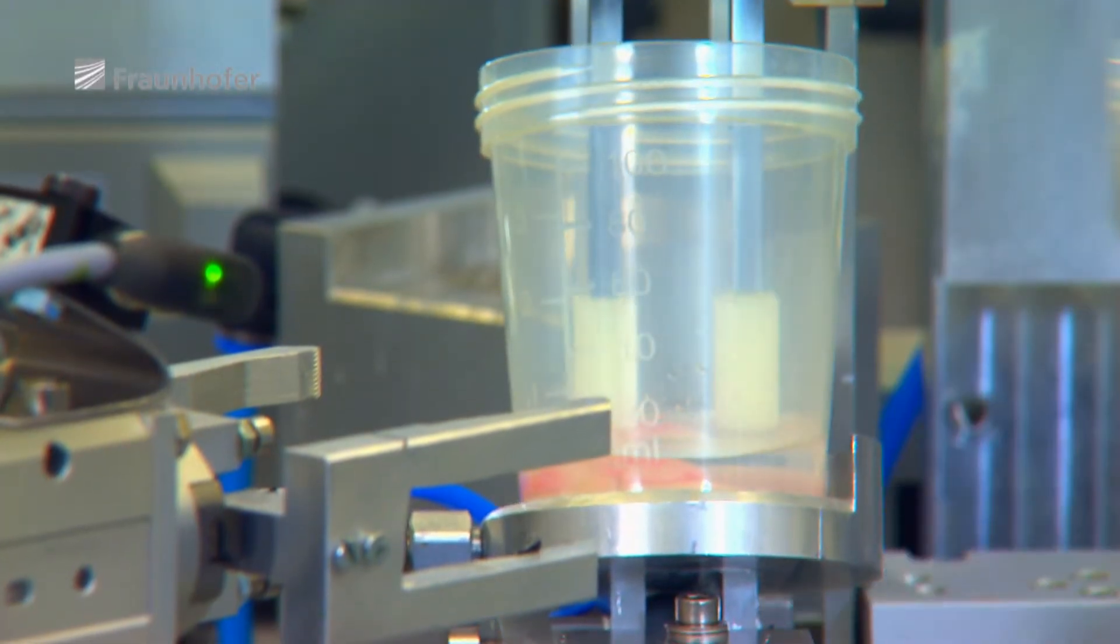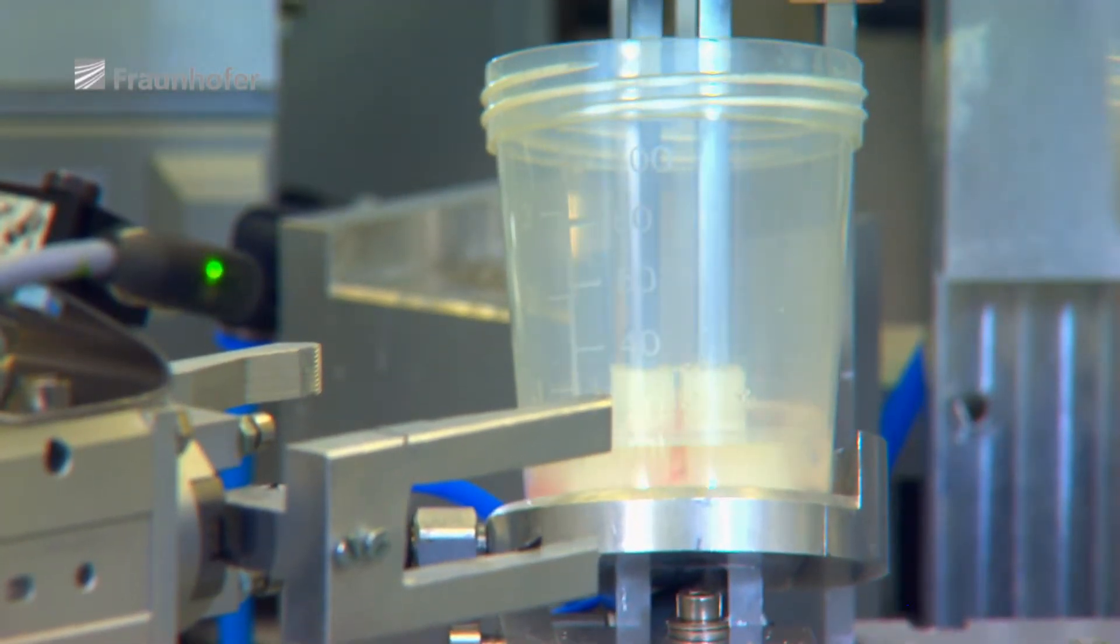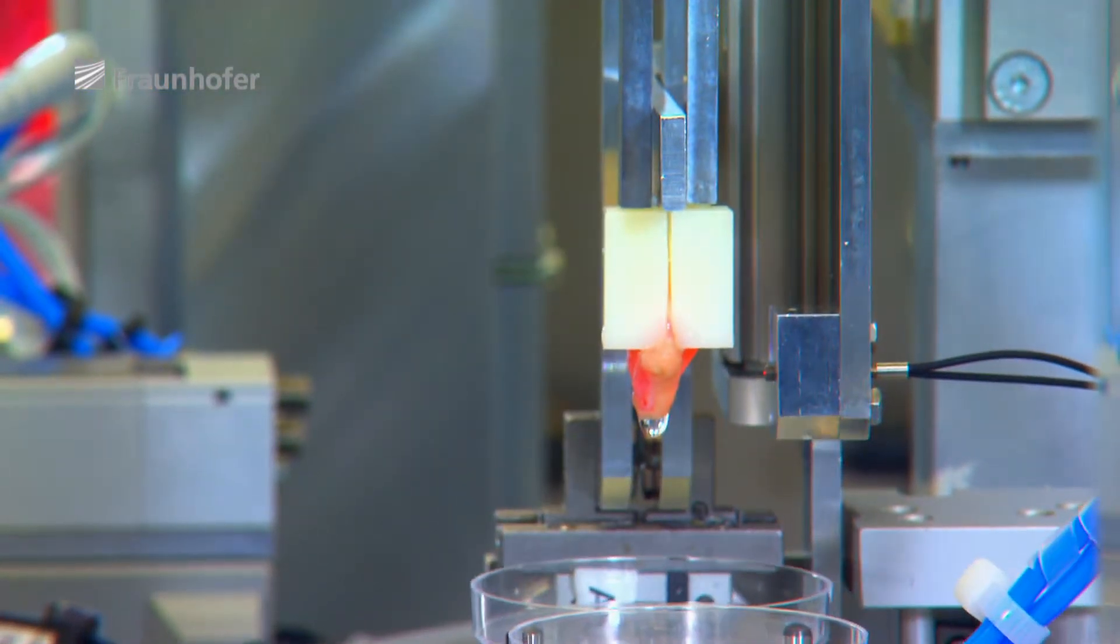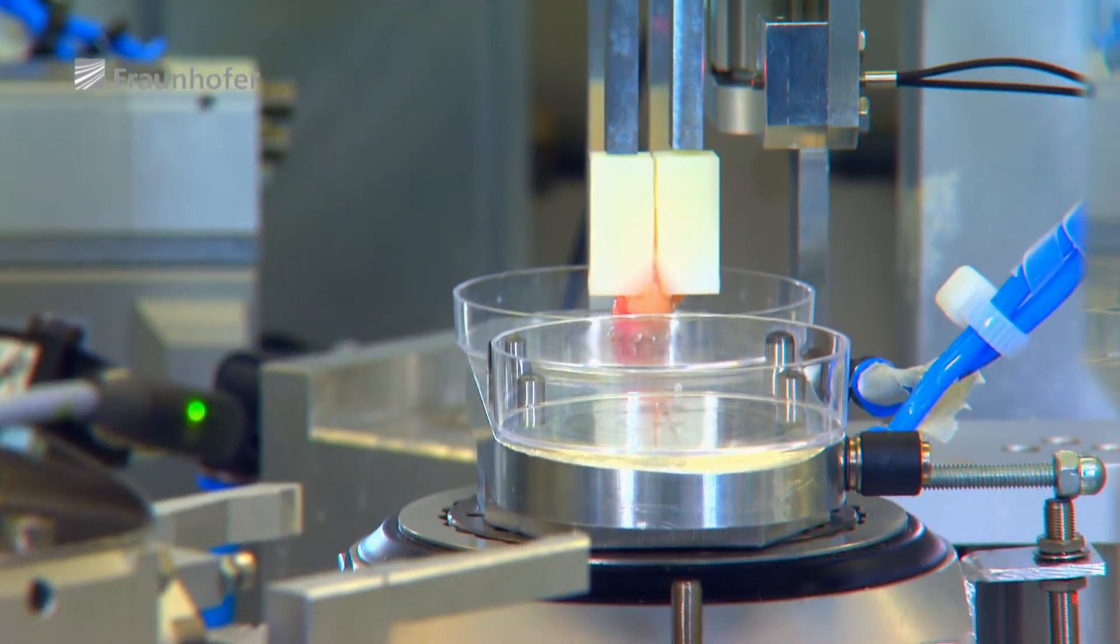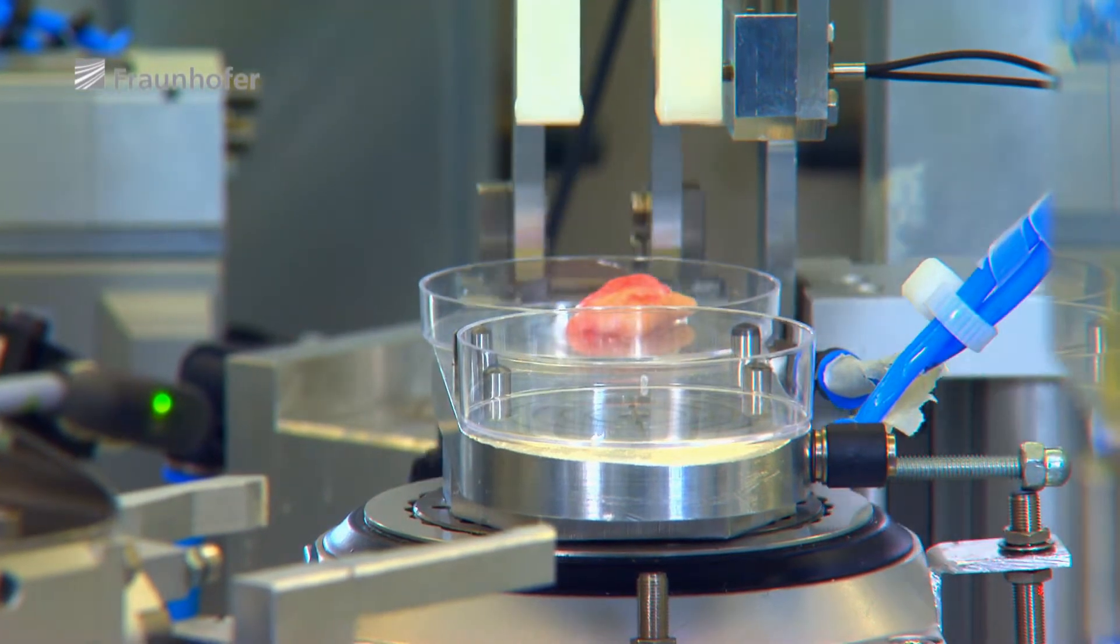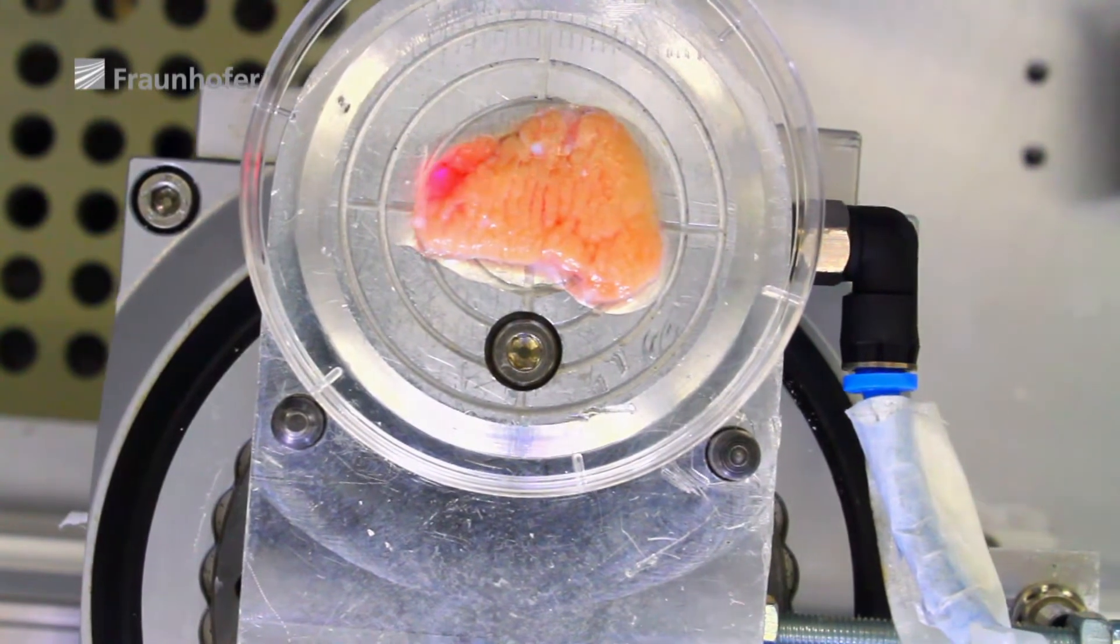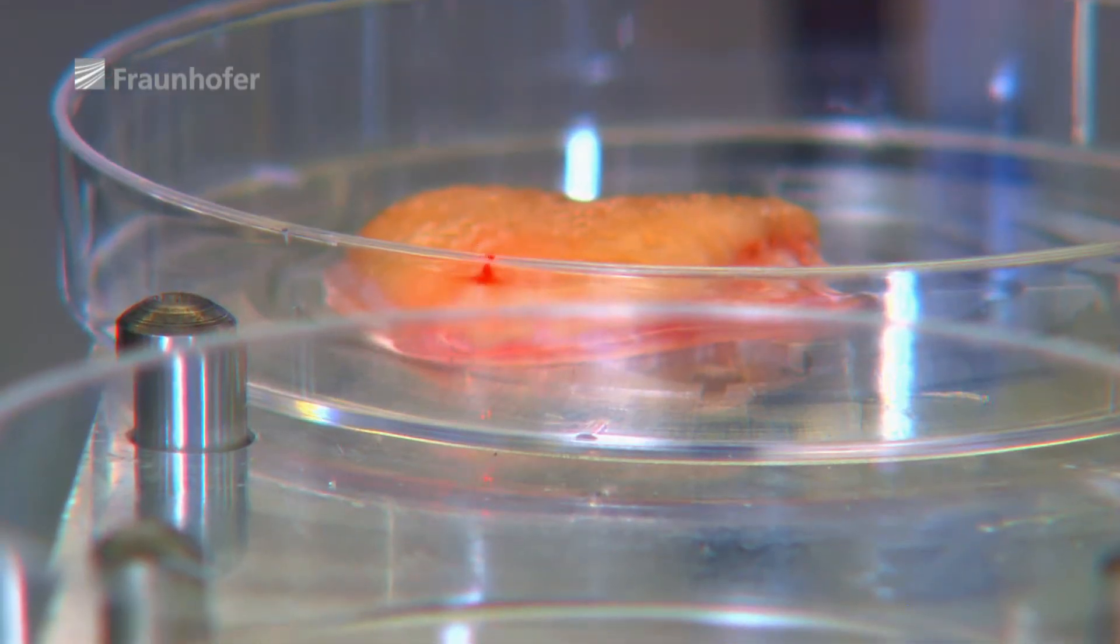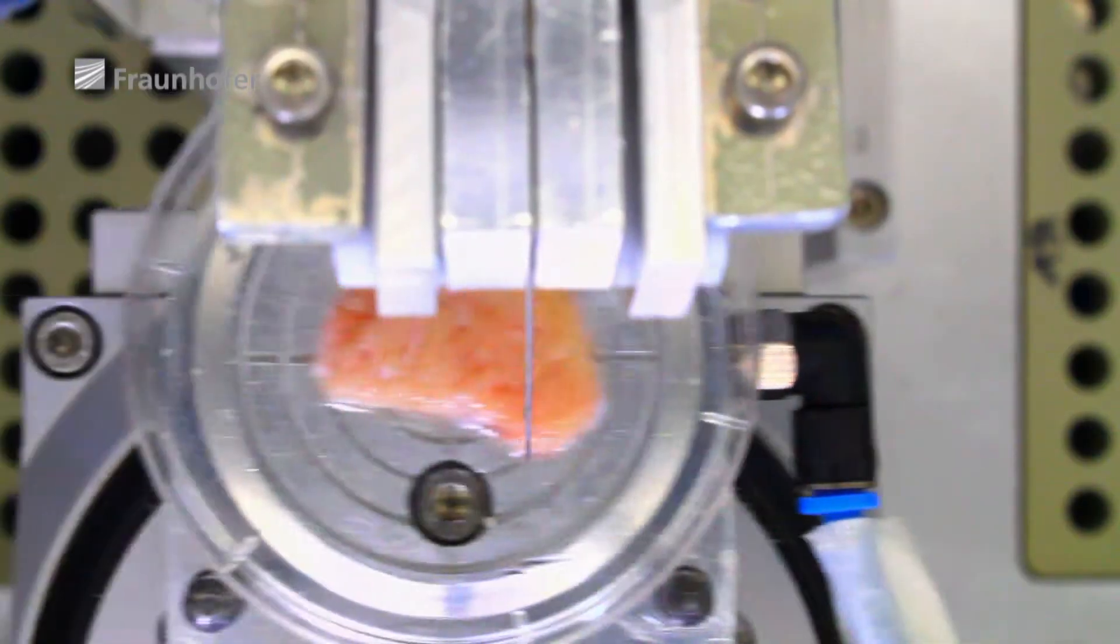The skin factory consists of three fully automated modules. In the first module, the equipment separates skin cells from a piece of human skin the size of a postage stamp. A laser beam measures this biopsy. Then, the sample is minced by a small blade, allowing the individual skin cells to be extracted.